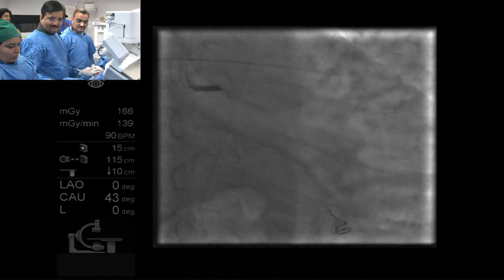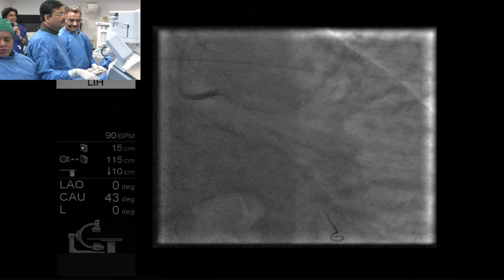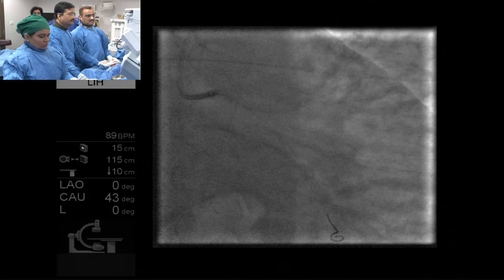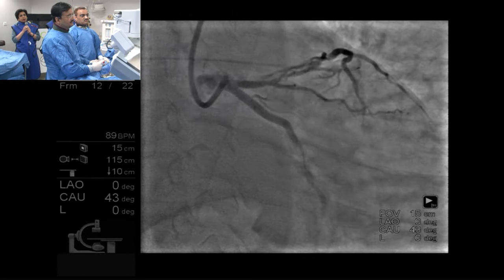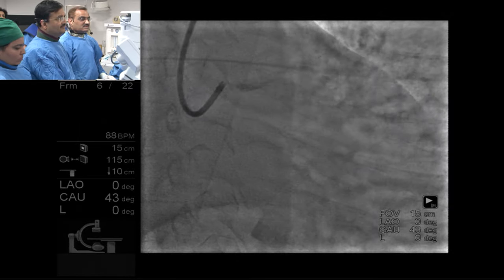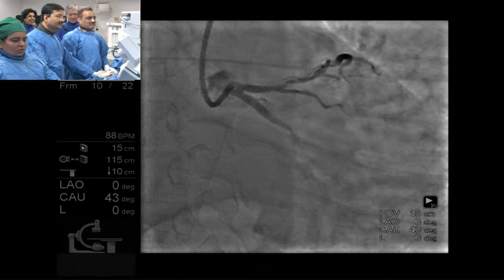It's a very challenging case, isn't it? I mean, the dissection and then going 90 degrees. Can we do OCT in this case, just prior to ballooning, to see the morphology of that spontaneous dissection channels? I was actually told to do this stent the cheapest way I can, so I do not know whether we have a free OCT catheter right now. Well, even without OCT, it looks very tough, so I don't think I need to do it.